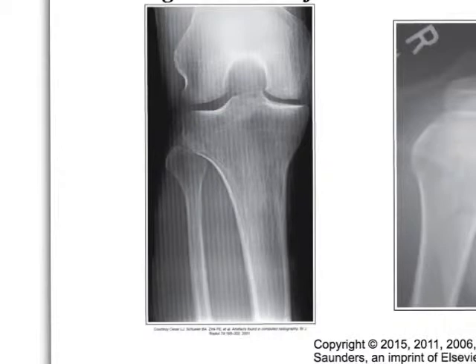Okay? So let me draw a picture of what this is talking about so that we understand it, because we're talking about two different sets of lines, right? So we have a grid, right, like this, that is blocking radiation from striking the image plate, okay? And then in addition to that grid, and then we've exposed our image plate right here. So this is our image plate that we use this grid on. But then the laser is scanning in the same direction as the grid lines. When we put the CR plate in there to get our image, it is going to create an artifact. So we need to either change the direction the laser is scanning or change the orientation of the grid to prevent that kind of artifact.